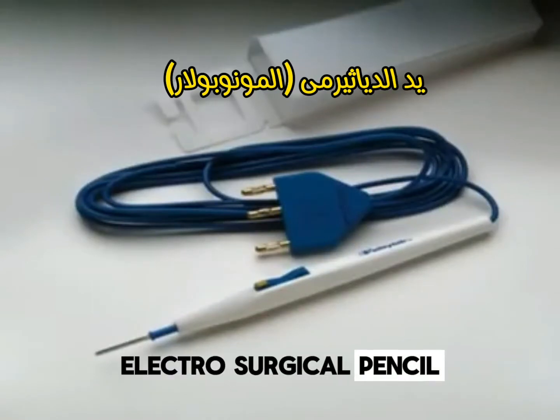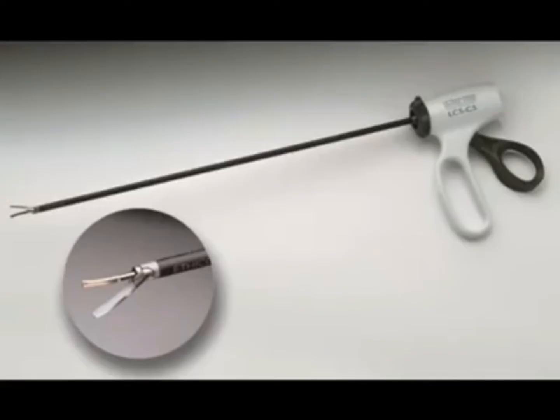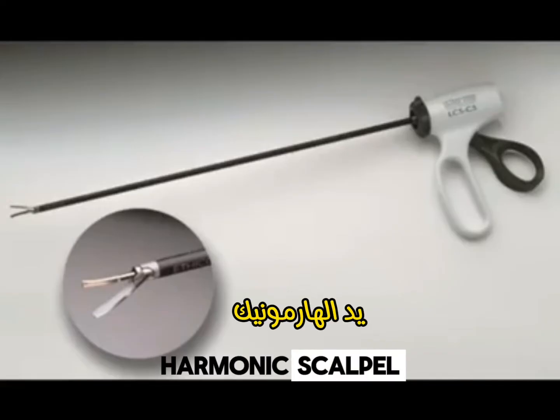Electrosurgical Pencil. Harmonic Scalpel.